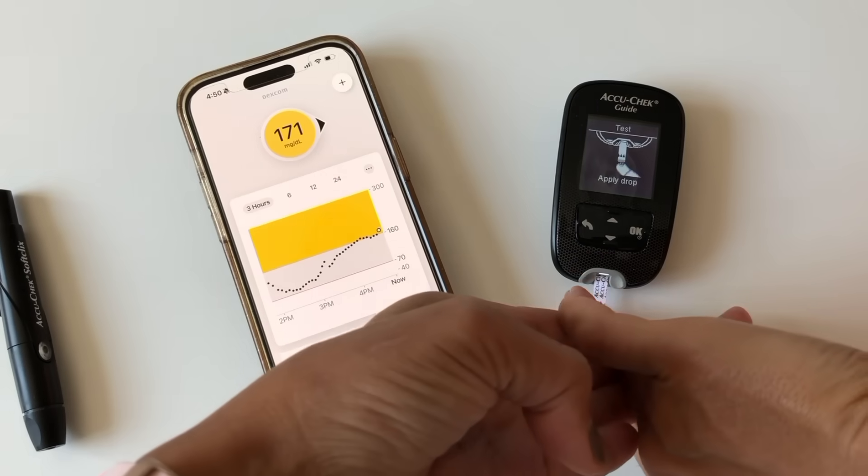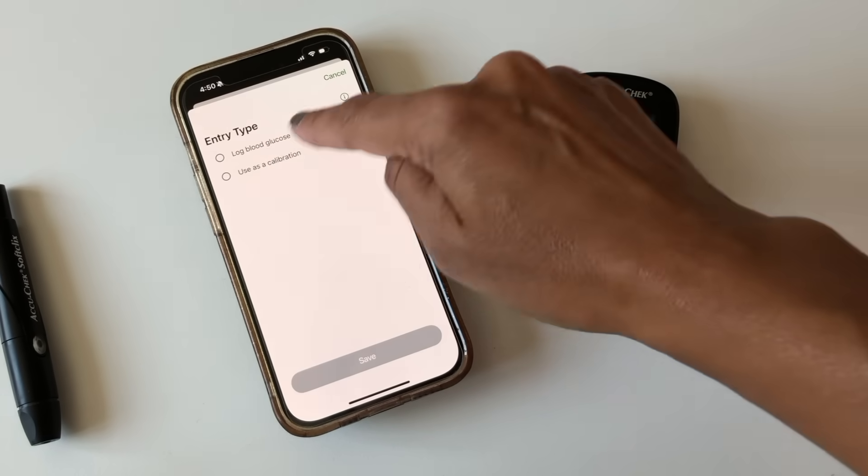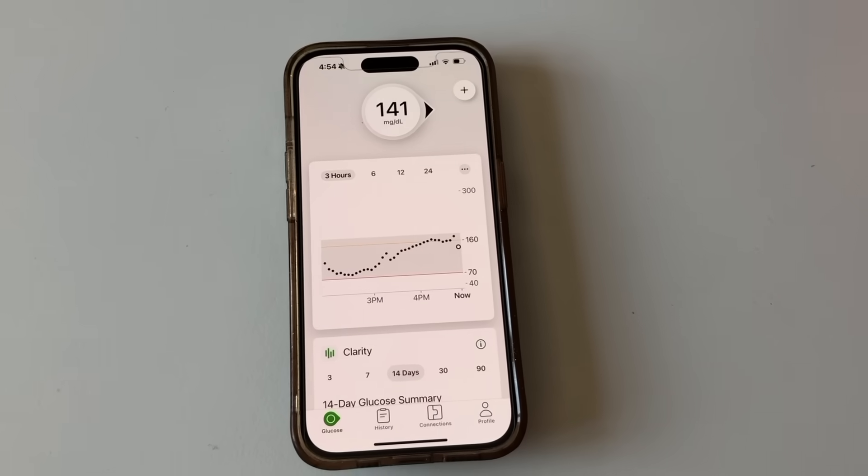My rule of thumb is I generally try not to calibrate within the first 12 hours, and I only calibrate if I see several finger sticks being more than that plus or minus 20% from my CGM reading. You calibrate the sensor by doing a finger stick — I usually do more than one to be sure I have an accurate blood sugar reading. You then click the little plus sign, use as calibration, and add the blood sugar reading. The sensor will then slowly adapt to what you've entered. Calibrations don't always work — sometimes the sensor won't accept a calibration and sometimes calibrating will just lead to a sensor failure. If that happens, you have to request a replacement.